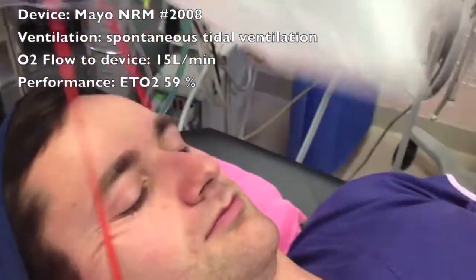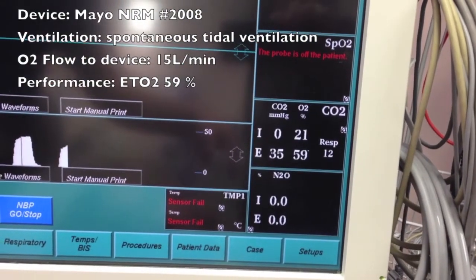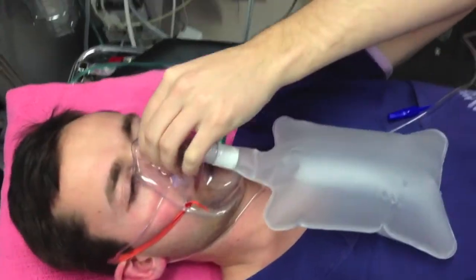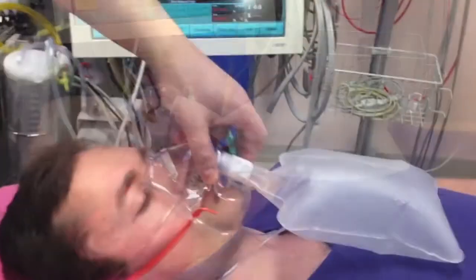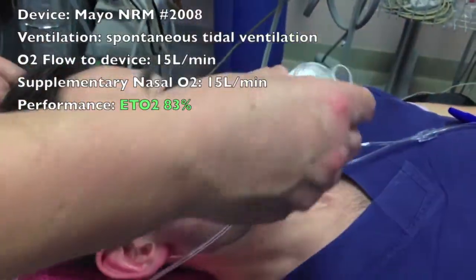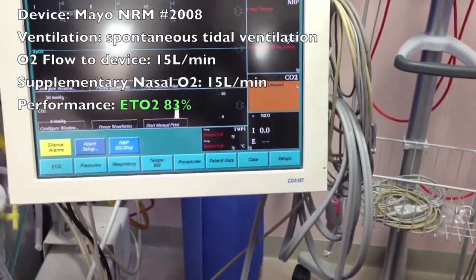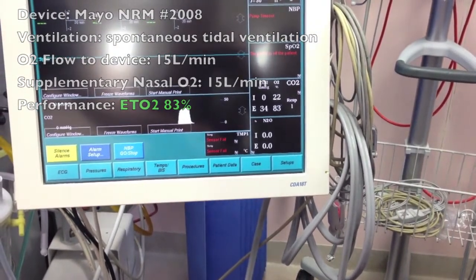Following a 3-minute period of breathing with this mask, an end-tidal oxygen of 59% is achieved. When oxygen flow to the standard non-rebreather mask is supplemented using nasal prongs attached to a second oxygen source at 15 litres per minute, this further raises the end-tidal oxygen to 83%. This end-tidal value is comparable to that achieved using devices which deliver an inspired oxygen concentration approaching 100%.